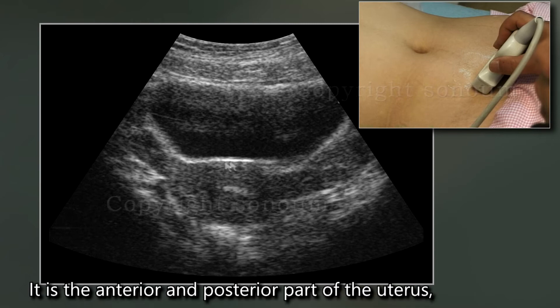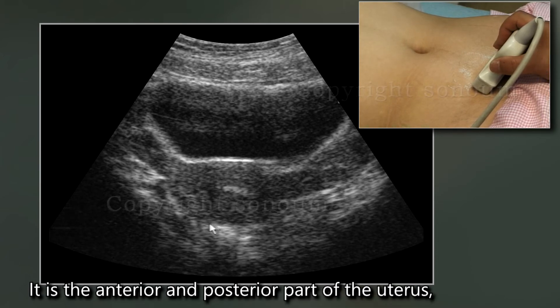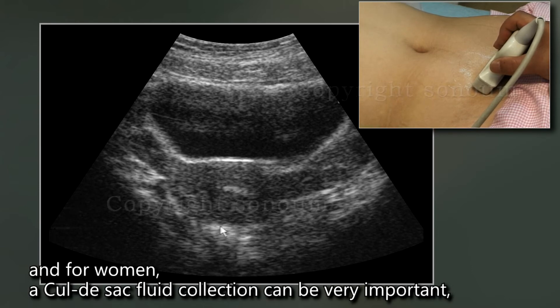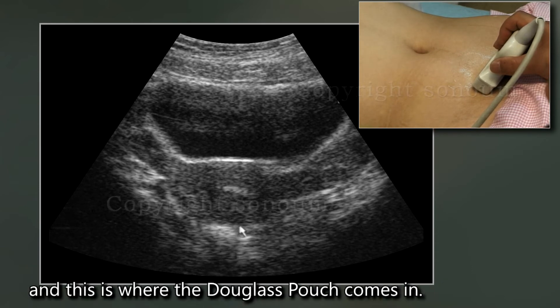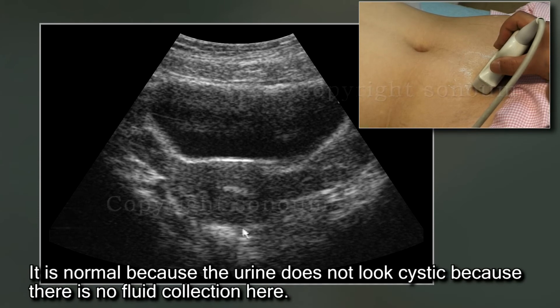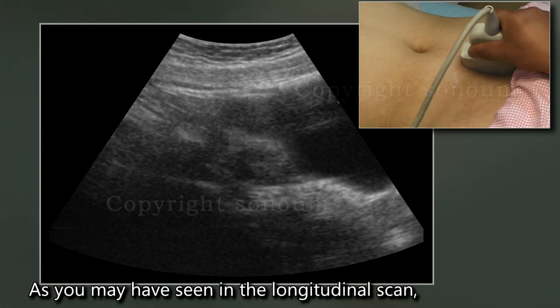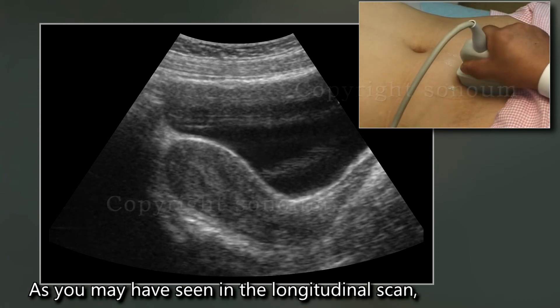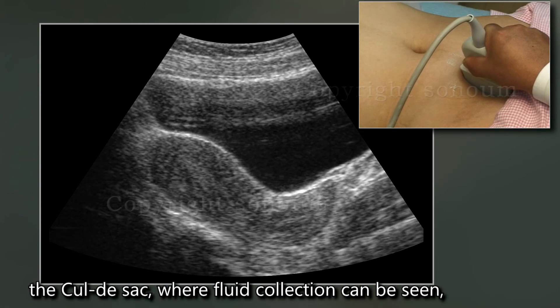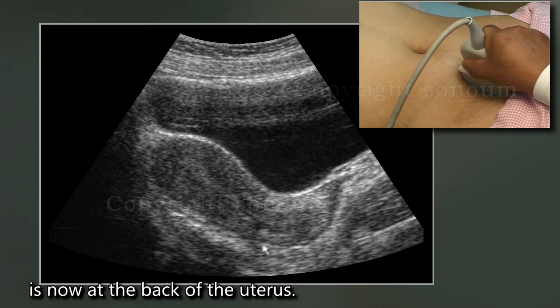This is the bladder — the anterior and posterior part of the uterus. For women, a cul-de-sac fluid collection can be very important, and this is where the Douglas pouch comes in. It is normal because there is no cystic fluid collection here. As seen in the longitudinal scan, the cul-de-sac where fluid collection can be seen is at the back of the uterus.